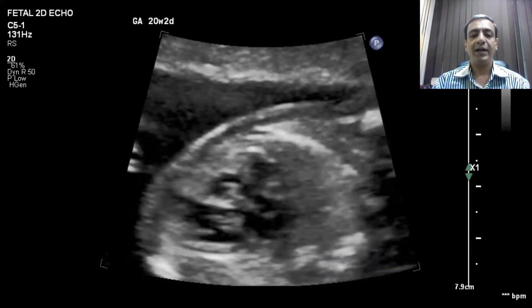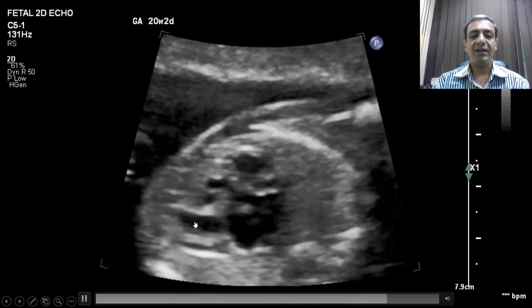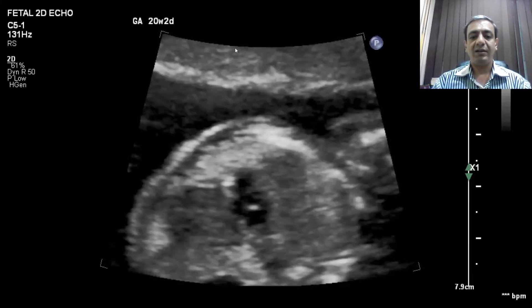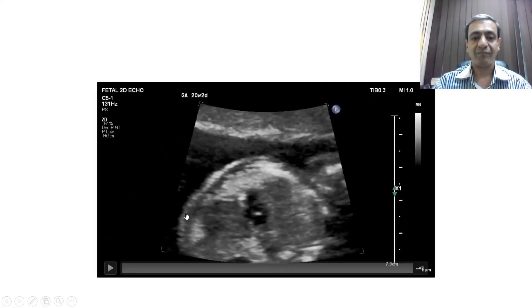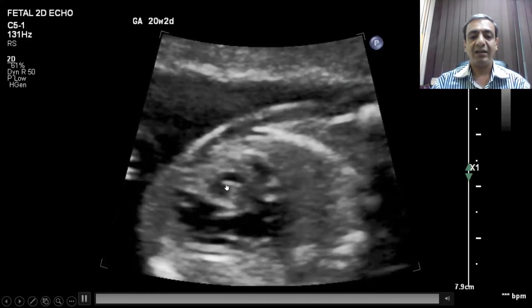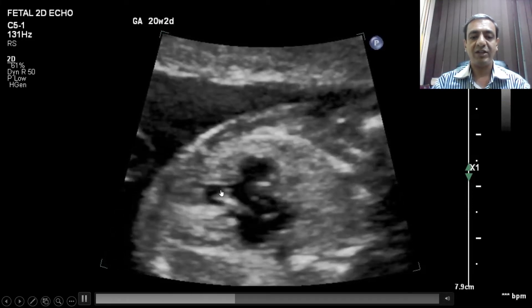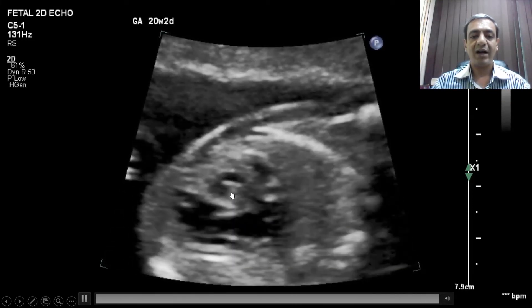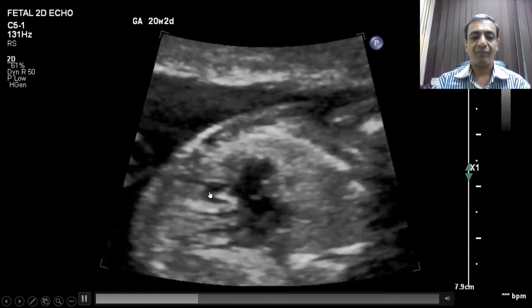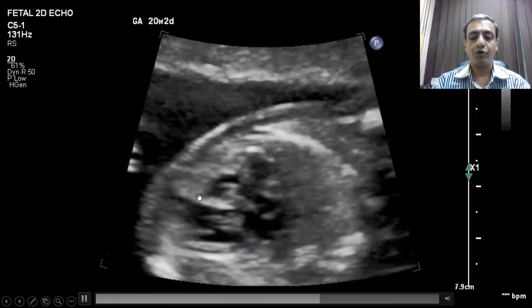Looking at this video, we can see the left ventricle is dominant and apex-forming, while the right ventricle is very small and the tricuspid valve is hardly opening. The opening is only in the inlet portion of the right ventricle — there is no trabecular portion.